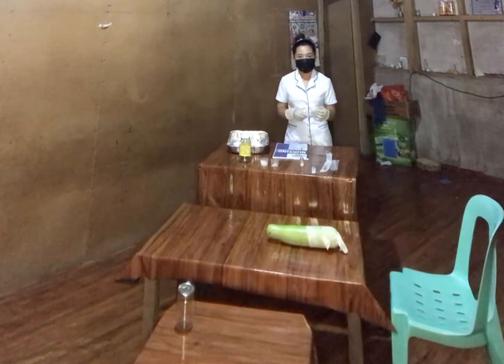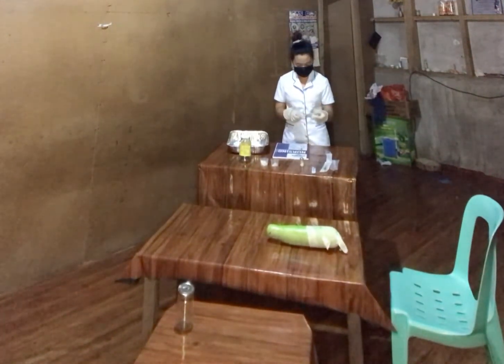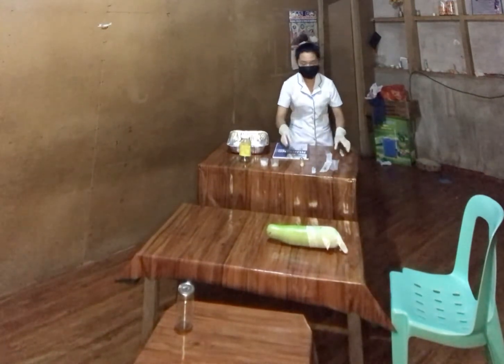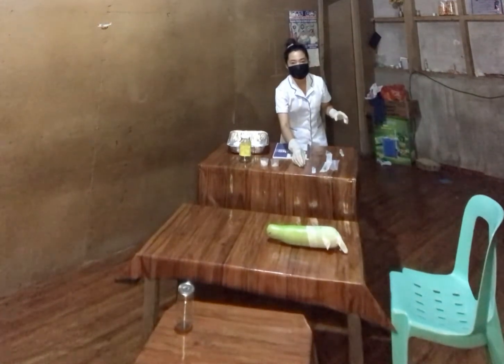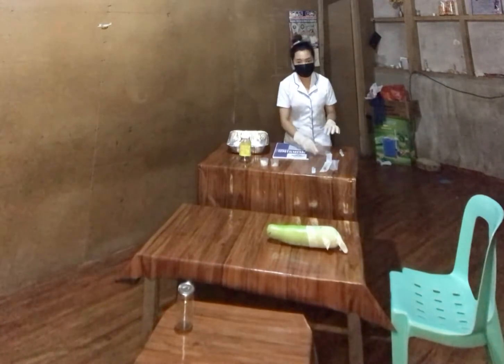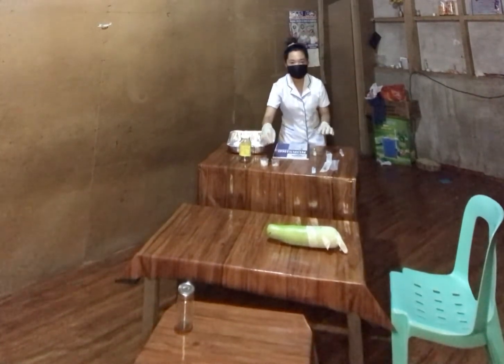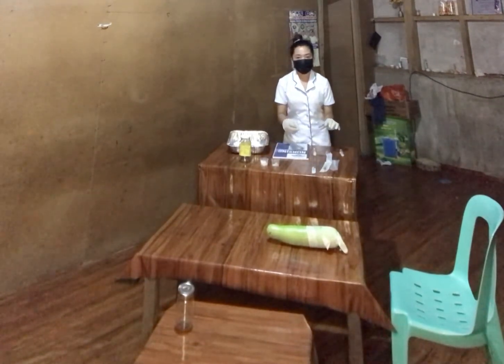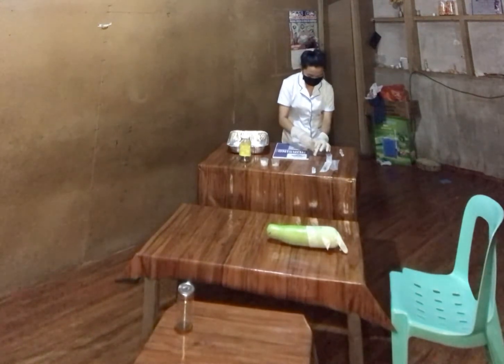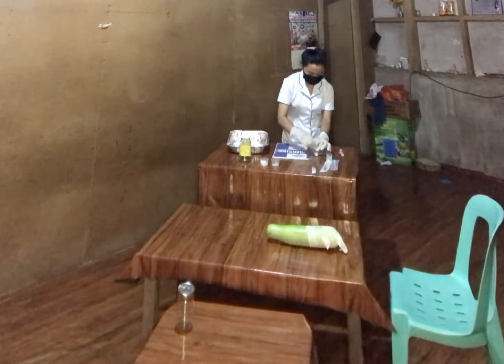Okay, set this aside first. To open the medication vial, open the vial. So I will set this aside in this area. Clean the surface of the rubber, so I will clean this using a cotton ball soaked in alcohol. So now I take the syringe and cap. I will open this and I will clean this.